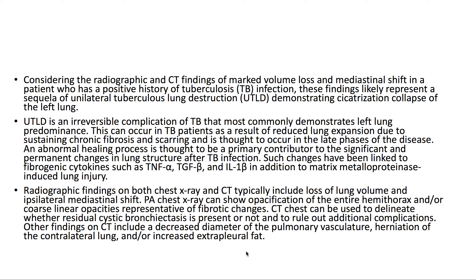Radiographic findings on both chest x-ray and CT typically include loss of volume within the lung and ipsilateral mediastinal shift. PA chest x-ray can show opacification of the entire hemithorax and/or coarse linear opacities representative of fibrotic changes. CT chest can delineate whether residual cystic bronchiectasis is present and rule out additional complications. Other CT findings include decreased diameter of the pulmonary vasculature, herniation of the contralateral lung, and/or increased extrapleural fat.